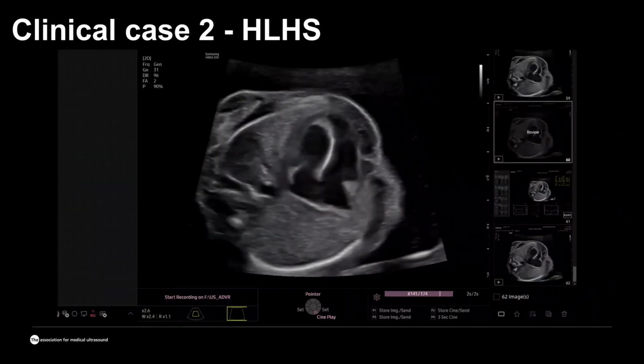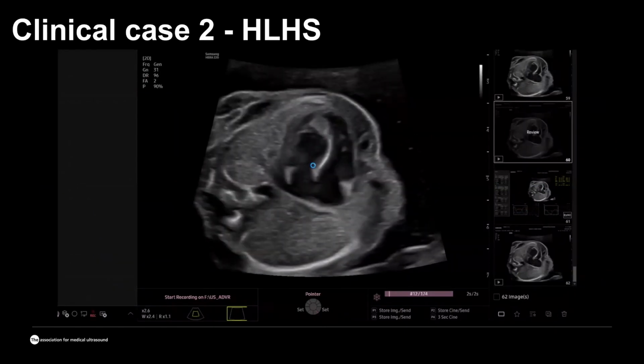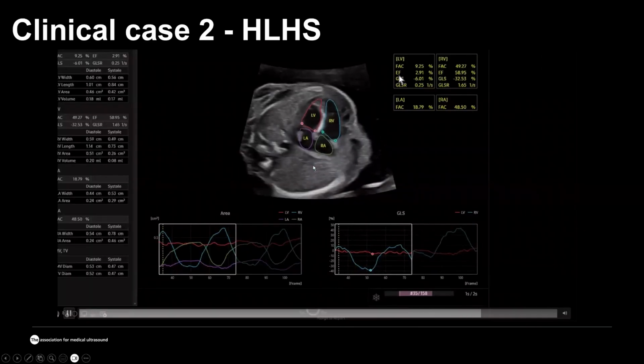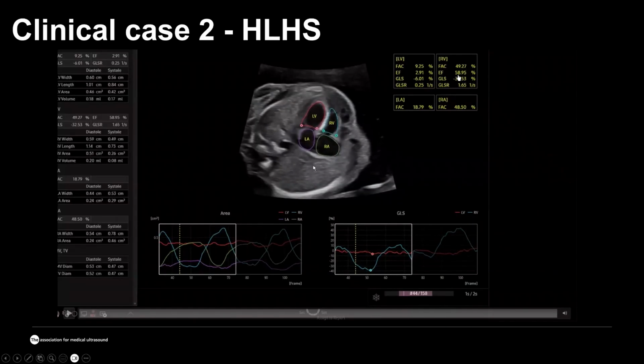And in order to try that new software, I was able to apply that to this heart. And I was just curious if that AI really shows me what it's supposed to. And you can clearly see here that the ejection fraction for the left ventricle is basically nothing. It's 3%, while for the right ventricle, it's 60%, and it's normal.